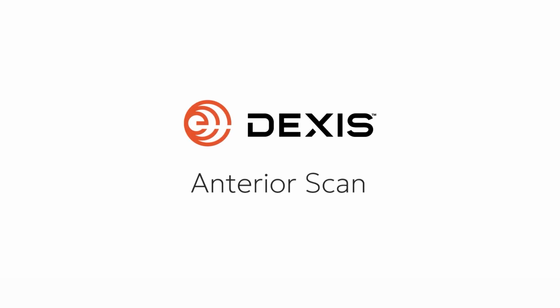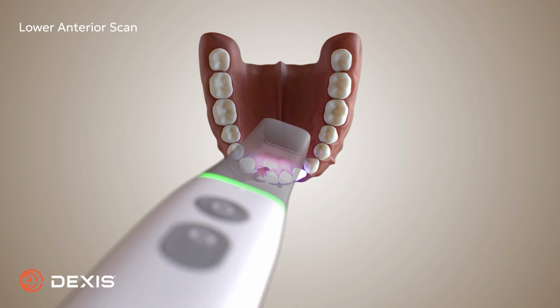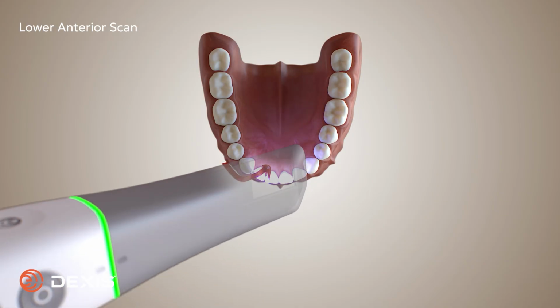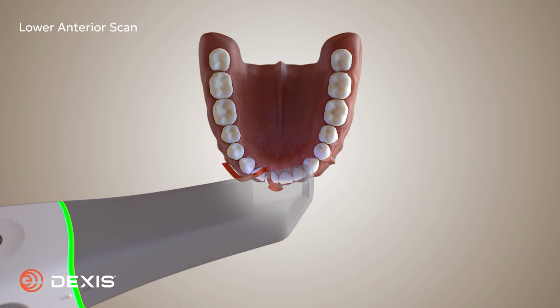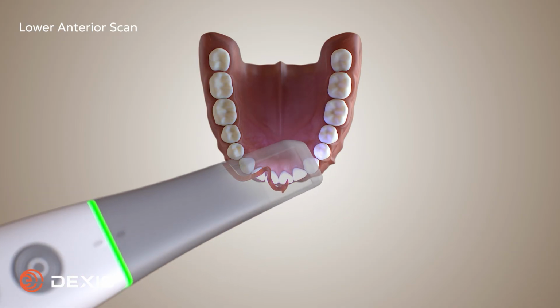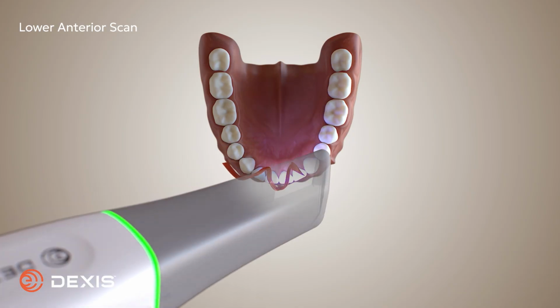Anterior scan. Begin on the lower arch. Place the scanner on the facial surface of the canine, then glide from facial over the incisal edge to the lingual surface. Move to the lateral and repeat the same motion, lingual over the incisal to the facial. Continue this zigzag pattern until all anterior teeth are captured.